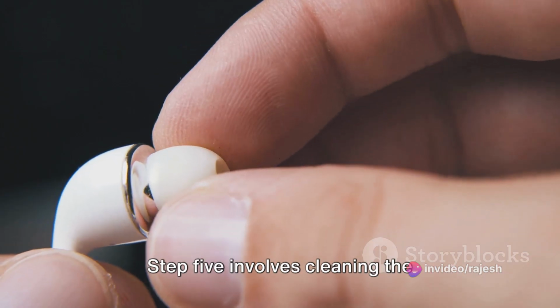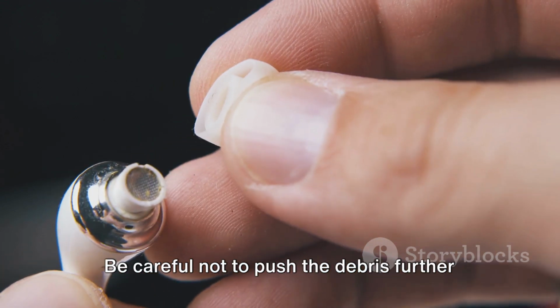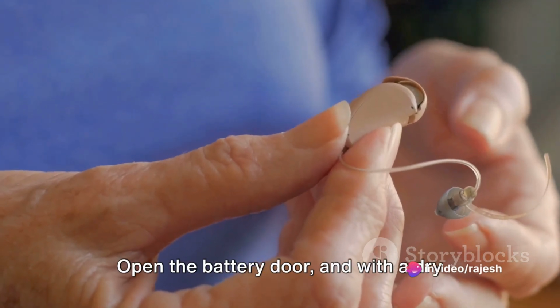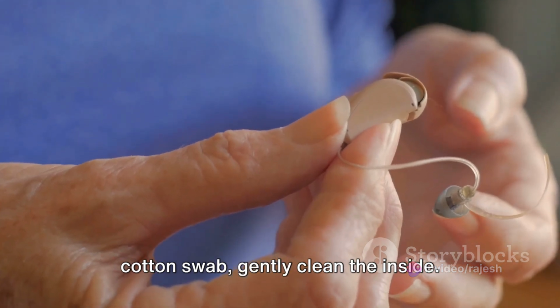Step 5 involves cleaning the microphone port. Use a soft brush to gently sweep away any debris. Be careful not to push the debris further into the port. Step 6, you'll want to clean the battery compartment. Open the battery door, and with a dry cotton swab, gently clean the inside.